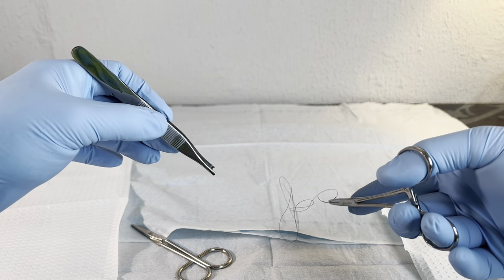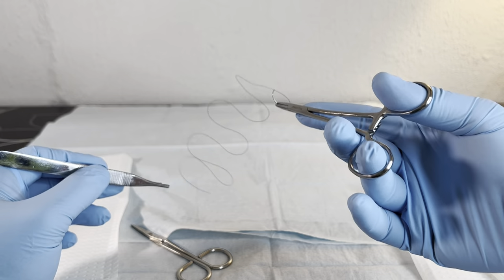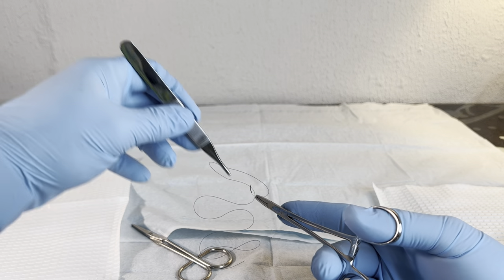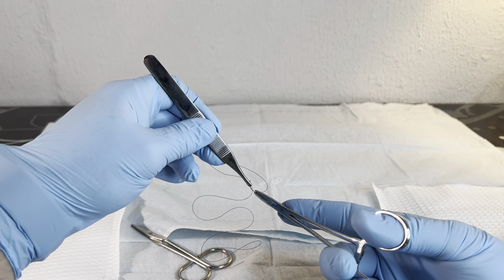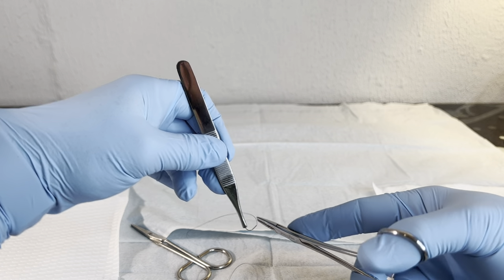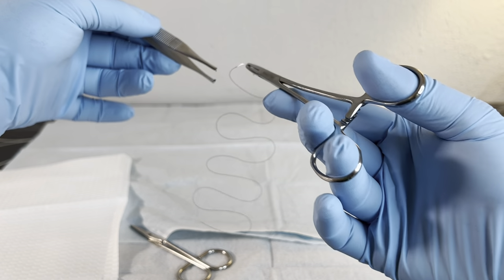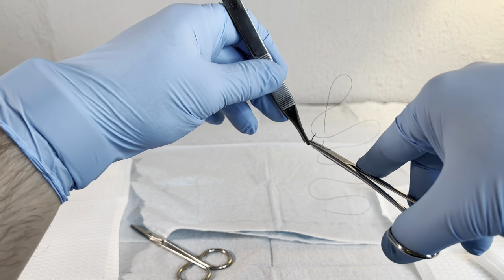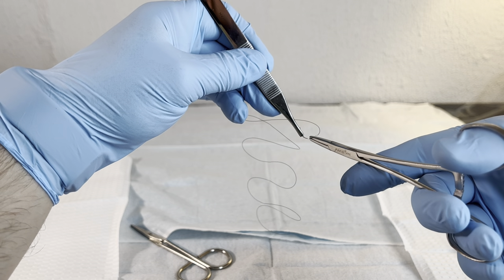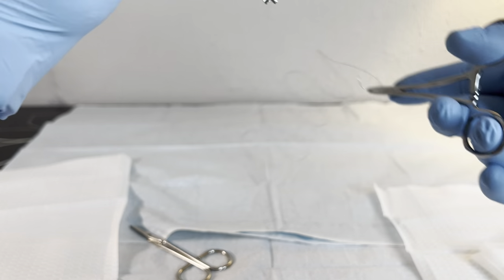After every push through — whether you're going to do one wound edge, pick from the middle, the other edge, or close it in one single throw — at the end you're going to need to grasp the needle as it comes out of the other edge of the wound, release, and then either drive through just with a push or come to the front, grasp, and pull back through. Once you've got that through, you're not going to be at the angle to use it again. So you're going to need to regrab, release, put it back into a position that you'll be able to throw the next suture and continue through, or you'll do your instrument tie and then repeat the process.